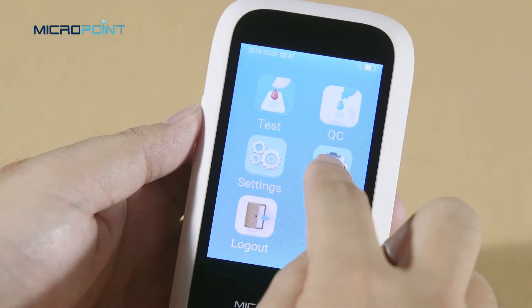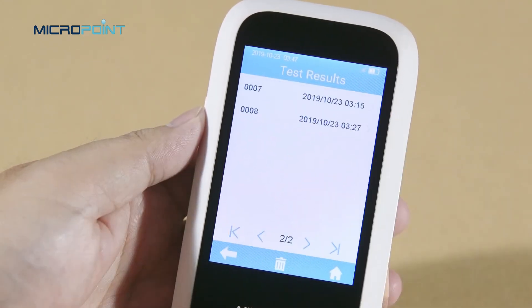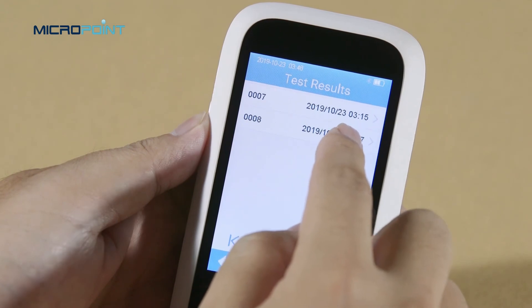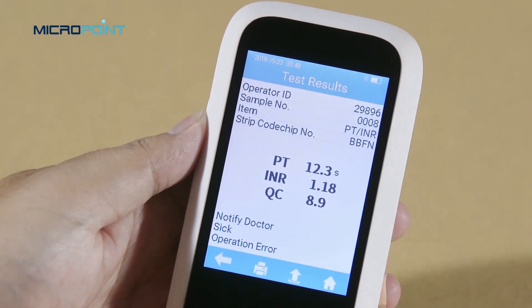Touch the result icon from the main menu screen to enter the result query screen. If there are multiple test results, please scroll through the display for all results. To view the detailed test result information, please click a result from the test result query screen.